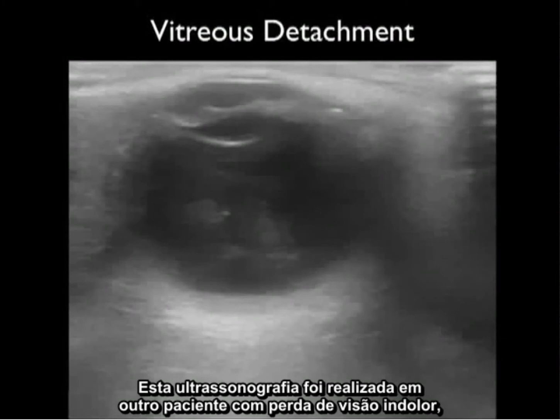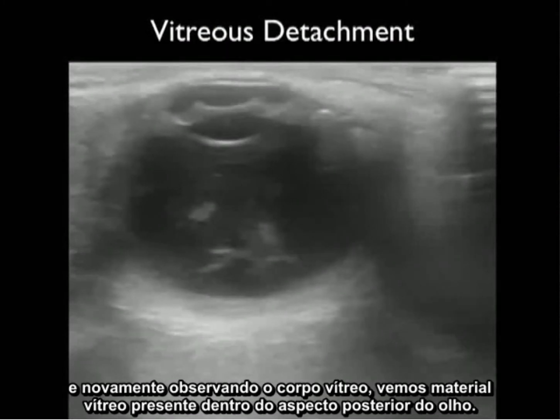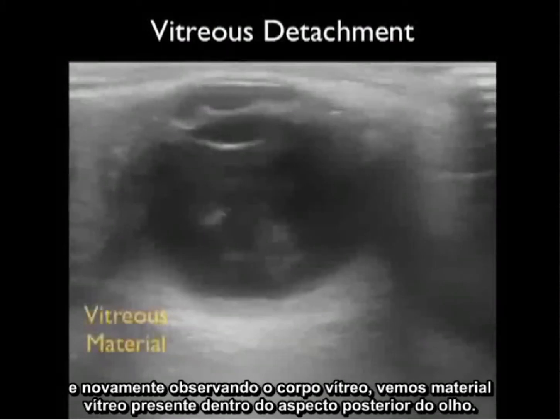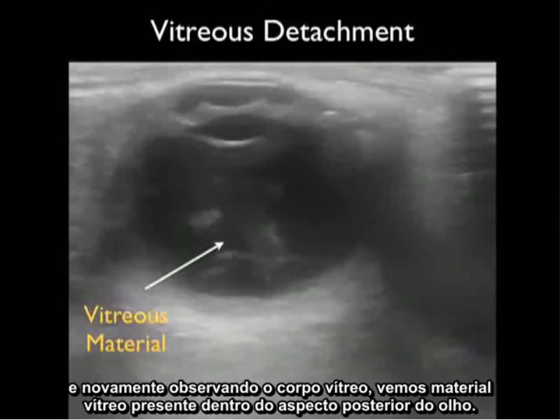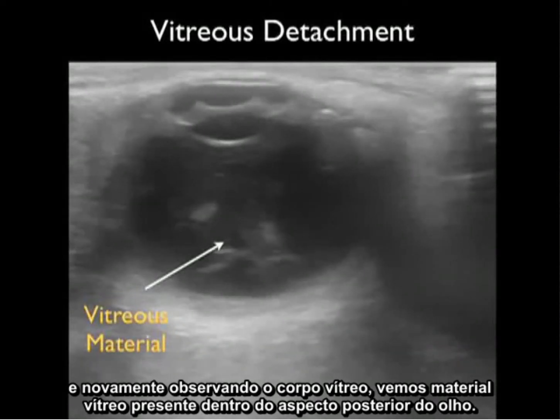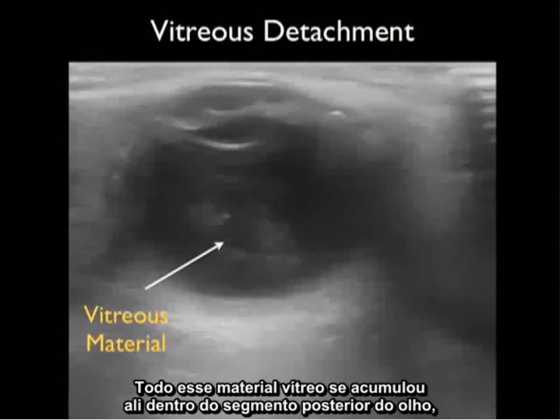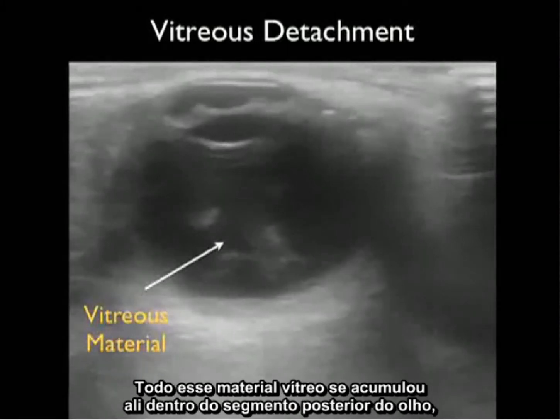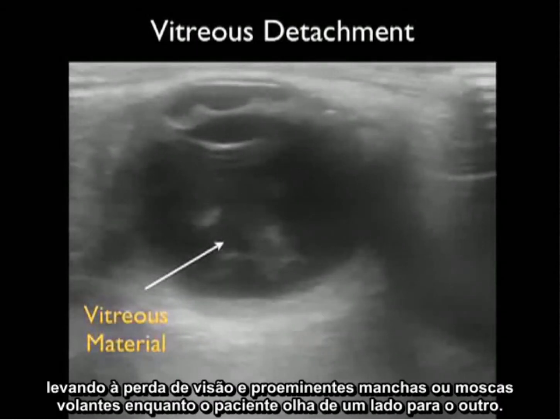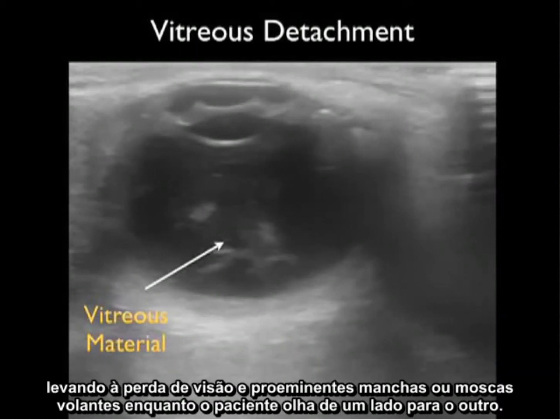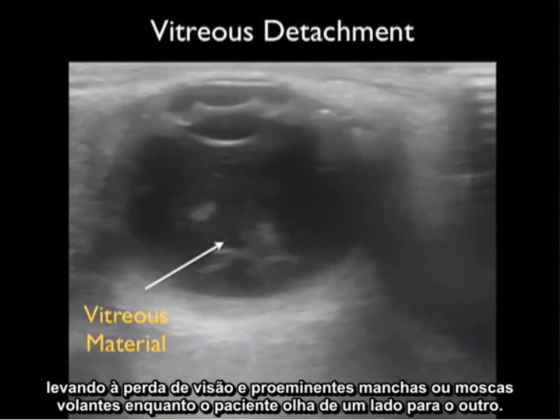This ultrasound was taken from another patient with painless loss of vision. Looking into the vitreous body we see vitreous material present within the posterior aspect of the eye. This is the classic appearance of vitreous detachment — vitreous material accumulated in the posterior aspect of the eye leading to vision loss and prominent speckles or floaters as the patient looked from side to side.